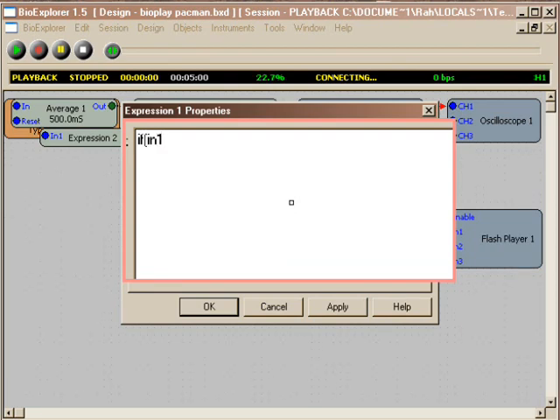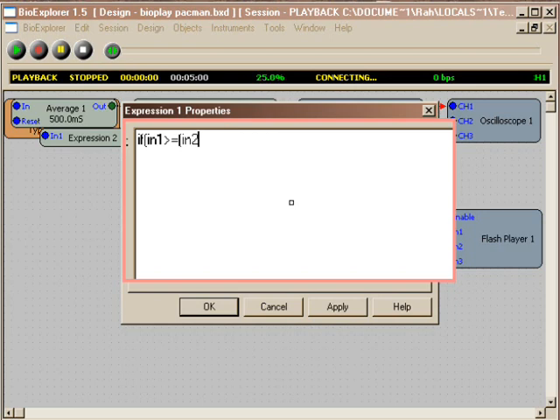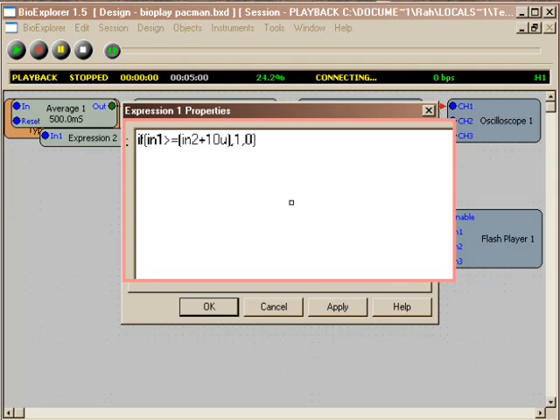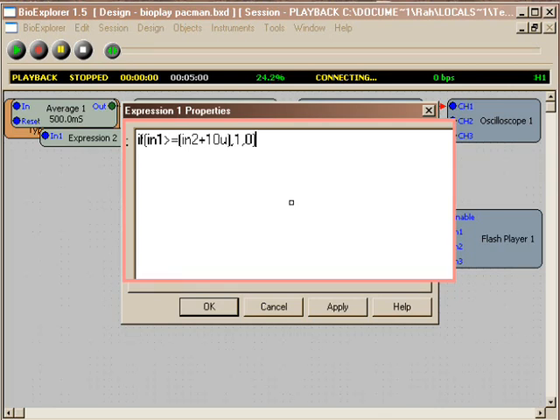The threshold on your threshold object is low, is the low output there. So what I'm writing in here is if, then, statement. If in one, which is the signal, is greater than or equal to in two, which is the threshold, plus 10 microvolts in this case, then one.